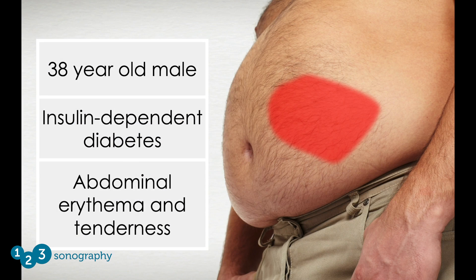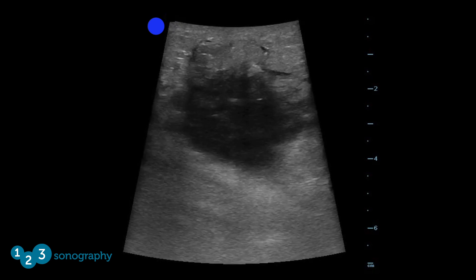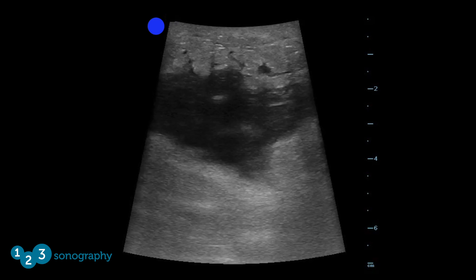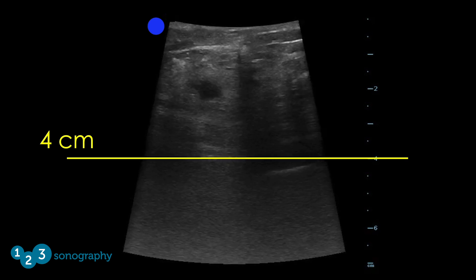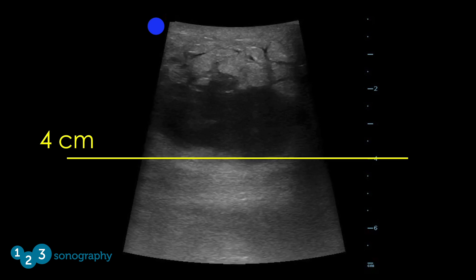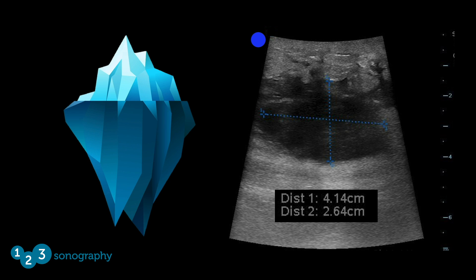Case number three: a 38-year-old male with insulin-dependent diabetes presenting with several days of abdominal erythema and tenderness at his insulin injection site. Using a curvilinear probe, a heterogeneous fluid collection is identified in the soft tissue over the inflamed area. The abscess is more than 4 centimeters deep — a linear array transducer would not likely visualize the full extent of the cavity. Because of the size on ultrasound, the patient was sent to CT and then to the operating room. This illustrates that an abscess can be like an iceberg — examination of the skin does not give an accurate indication of its full size. Ultrasound allows the clinician to fully appreciate the extent of the problem and choose the best management strategy.